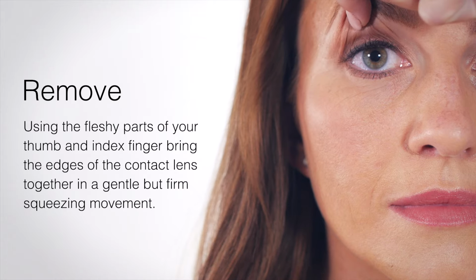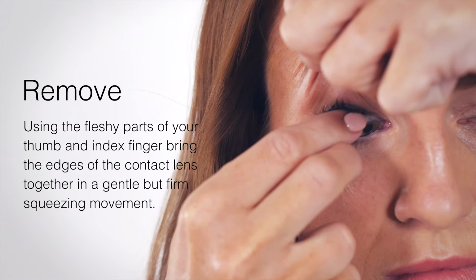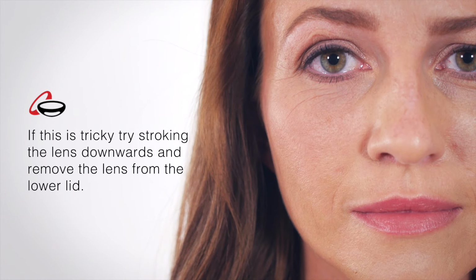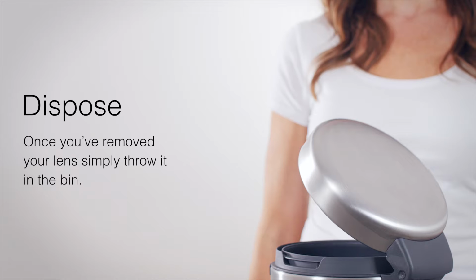Using the fleshy parts of your thumb and index finger, bring the edges of the contact lens together in a gentle but firm squeezing movement. If this is tricky, try stroking the lens downwards and remove the lens from the lower lid. Once you've removed your lens, simply throw it in the bin.